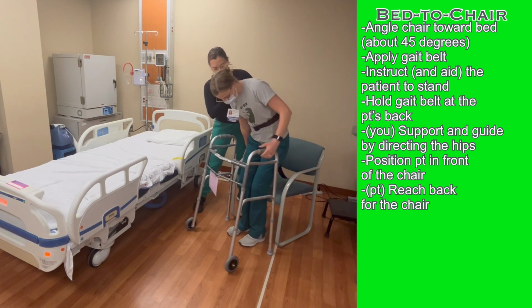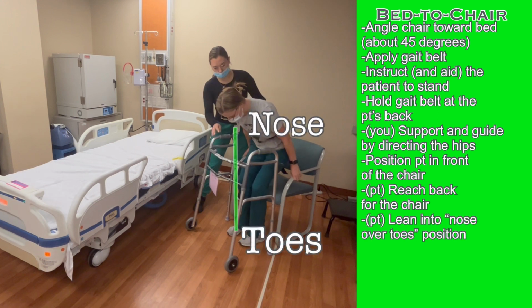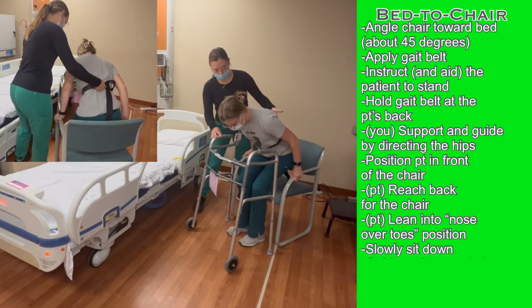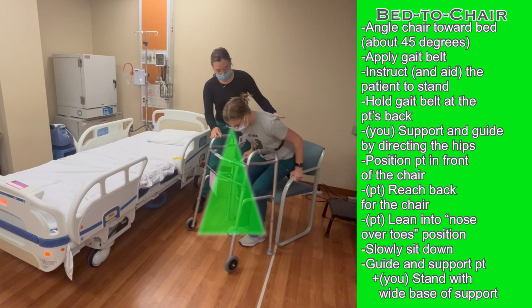Instruct the patient to reach back to the armrests of the chair. Lean forward to bring their nose over toes and slowly sit down. You can guide and support the patient as they descend into the chair. Stand with a wide base of support and ensure your strength comes from your lower body and not your arms and back.